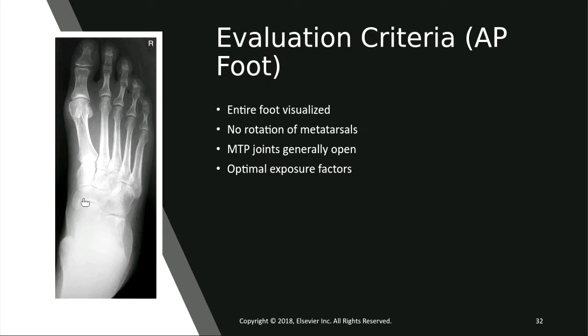Now this is actually a good foot. You're well penetrated in the forefoot, which is good. Toes are not burned out, and marker is appropriate. It is to the right of the extremity, and it's up top, and it's hanging correctly so that the radiologist can read that.